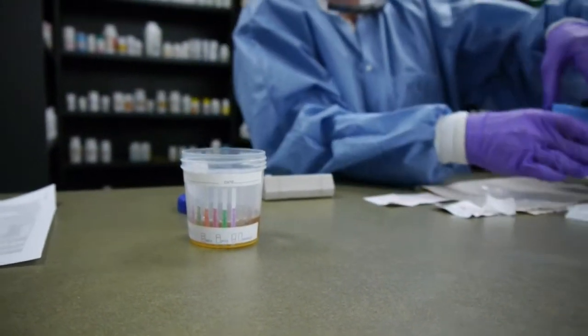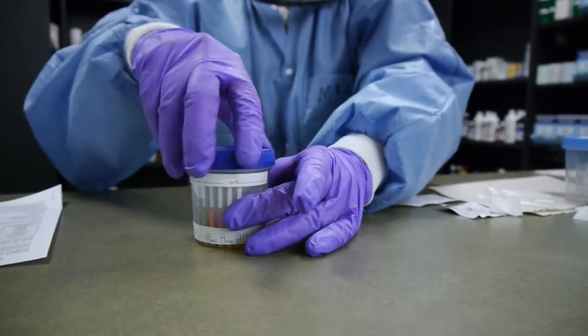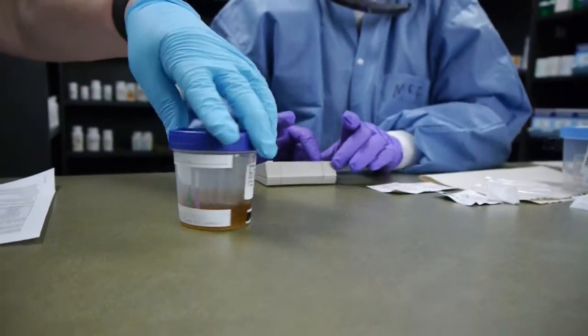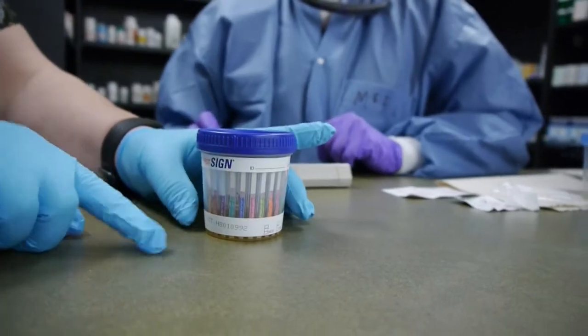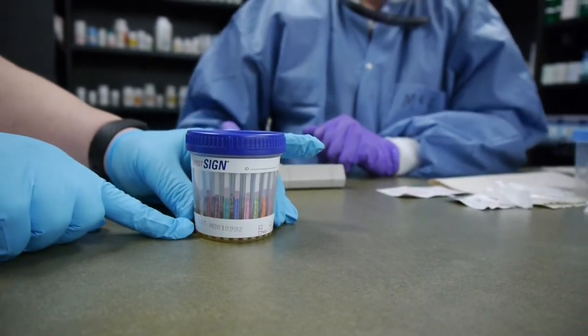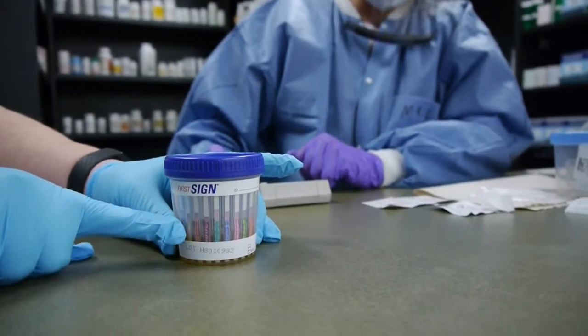What's kind of cool is you can see you're setting your timer. So in five minutes we're going to read it. The urine is now going up these urine test strips.